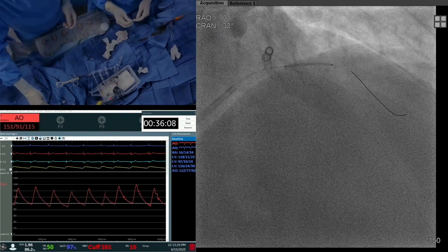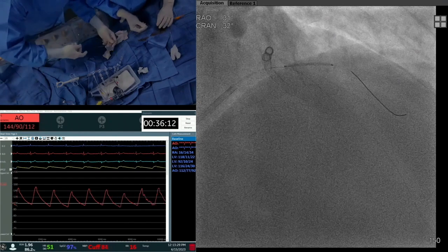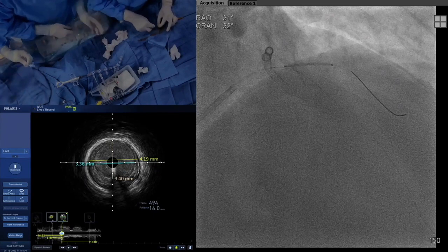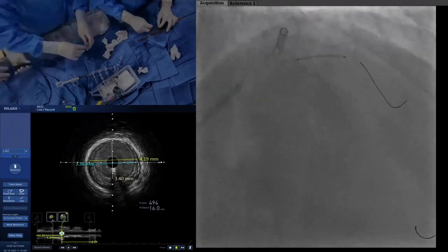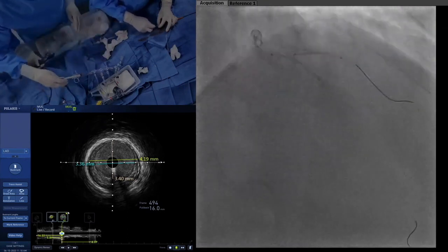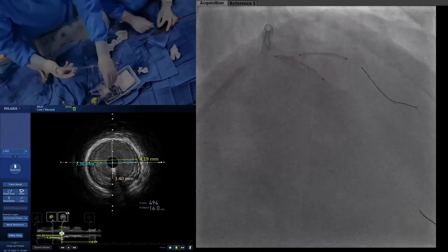From just the ostium to the healthy landing zone is 18 by IVUS for the main. So 20 is perfect. Normal to normal. But the ostium is not normal, and the goal is that we are going to nail the ostium of the LAD, not stent across. So 20 is perfect. Is that a 20? Yes. Good. Not stenting across? No, she wants to nail the ostium. She's following you, Dr. Colombo. How do you like that? Good.